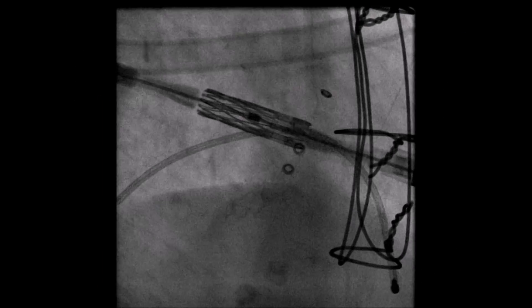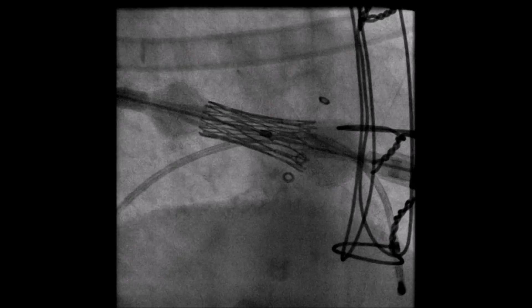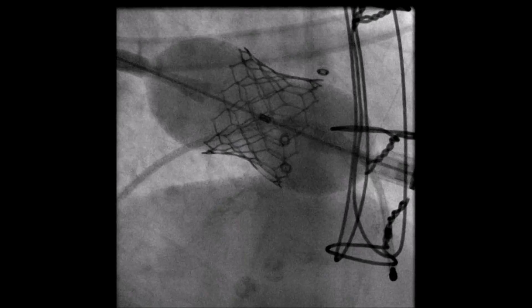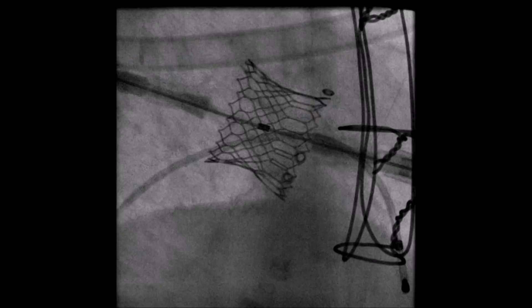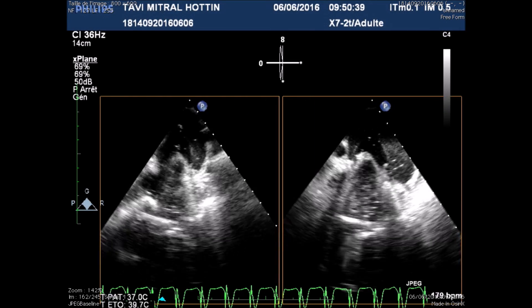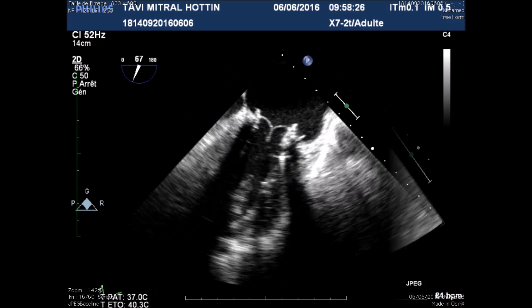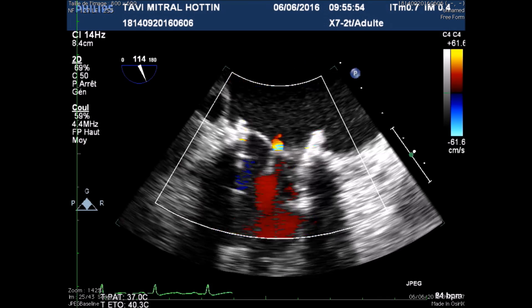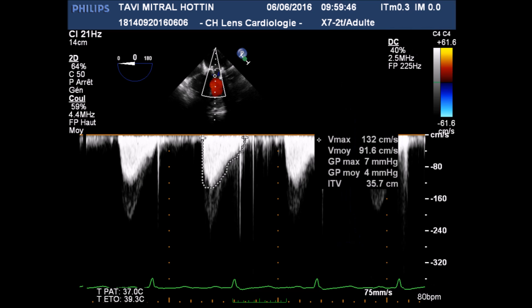The valve was deployed under ventricular rapid pacing with the balloon gently inflated under fluoroscopic and transesophageal echographic guidance. At the end of the procedure, echography showed a well-deployed Sapien-3 valve with a central trivial regurgitation, good coaptation, and a mean gradient of 4 mmHg.